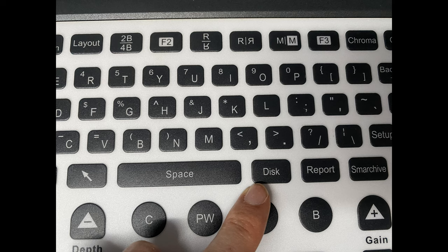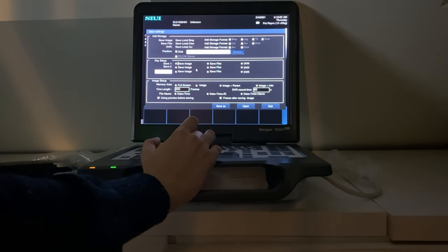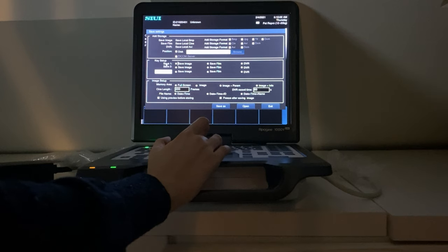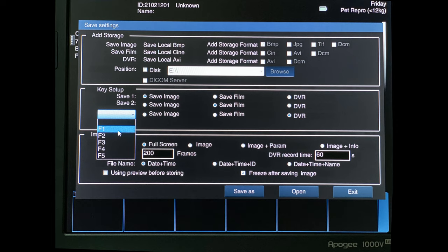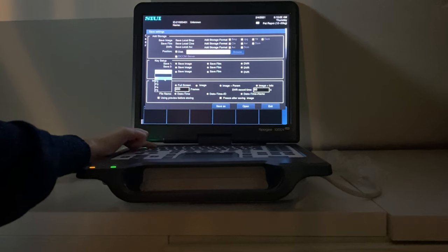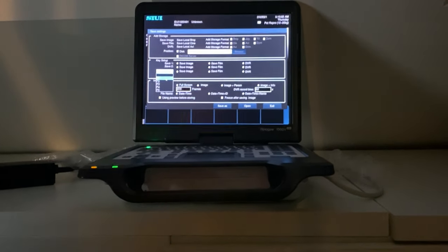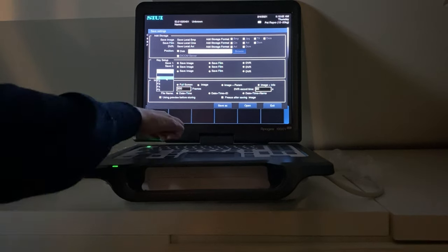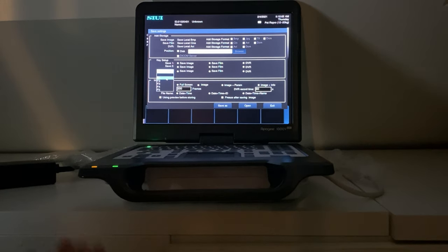If you click the disk button, which is just above M mode, that's where you can set up a constant continuous recording. By default, Save 1 will be an image and Save 2 will be a cine loop. DVR is a continuous recording, and you can set that to any key you like — so you can set it to F1. Then when you press F1 on the keyboard, it's going to start taking a continuous recording. F1 is up here, top left. A little red light will appear in the corner and it will keep recording until you press F1 again or freeze your image. So you're no longer bound by the constraints of a cine loop.